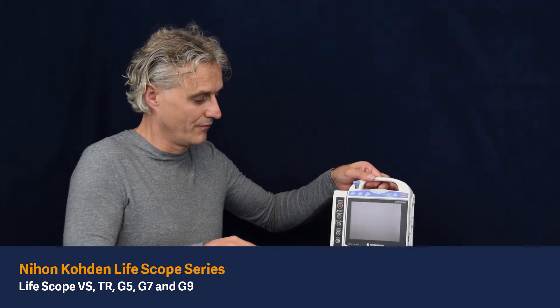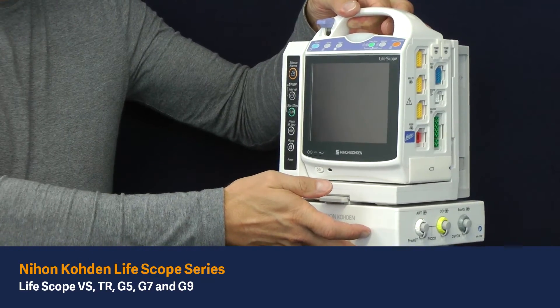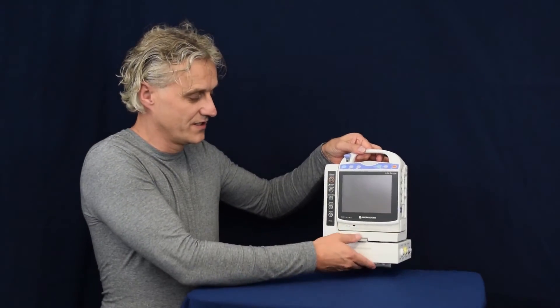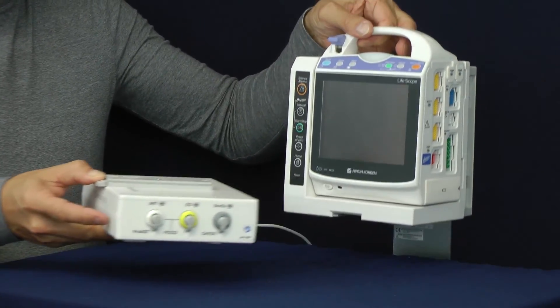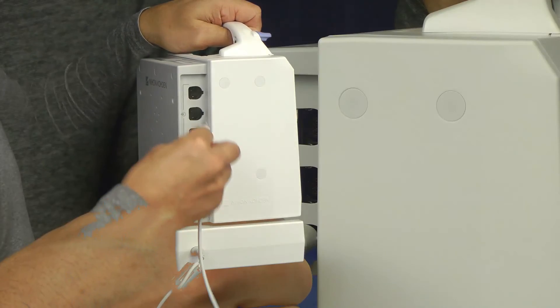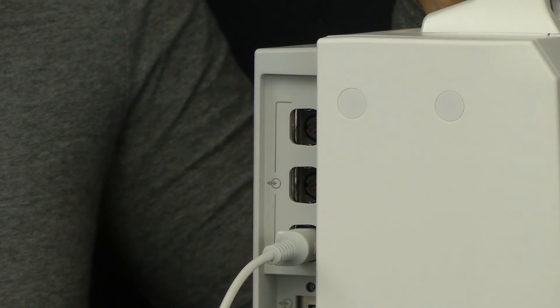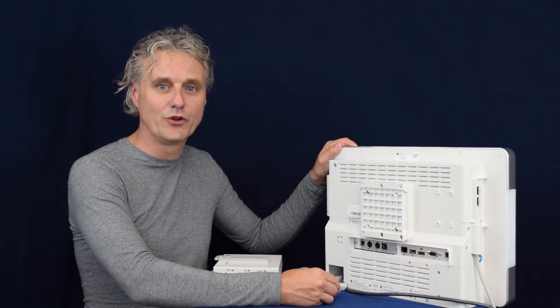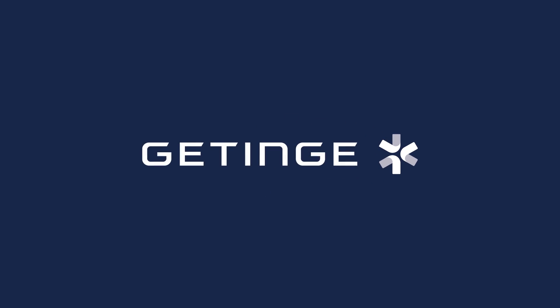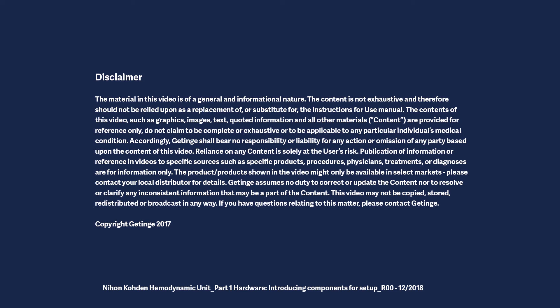To use the hemodynamic unit, move it into the input unit and slide it in until you hear a click. When you want to remove it, just put the clip down and remove it. When connecting the hemodynamic unit to the input unit, don't forget to connect this cable into one of the multi-linked sockets. The hemodynamic unit can be connected to any multi-linked socket.